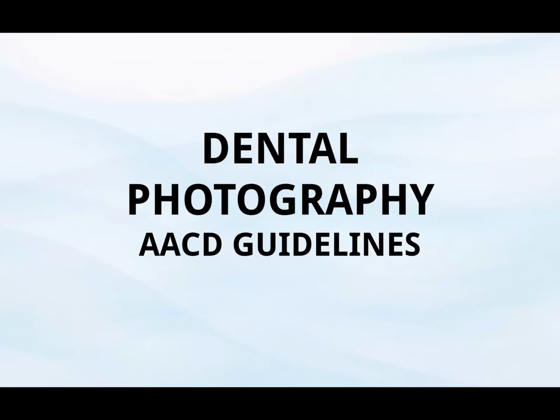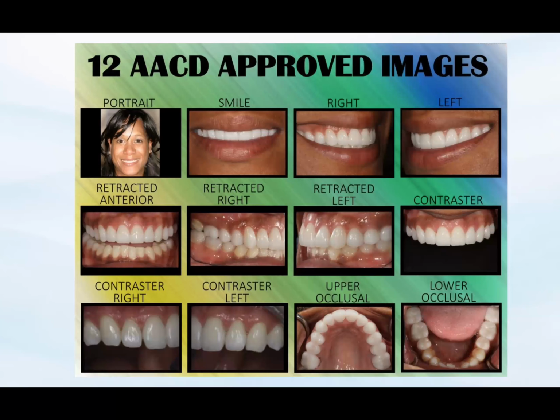Hello, in this presentation, we're going to be talking about dental photography, and we're going to be using the American Academy of Cosmetic Dentistry guidelines. The American Academy of Cosmetic Dentistry recommends taking 12 photographs for cosmetic or restorative cases.